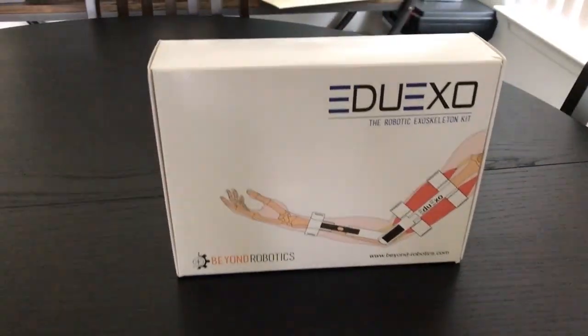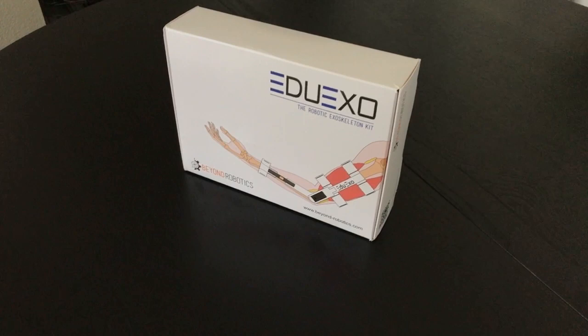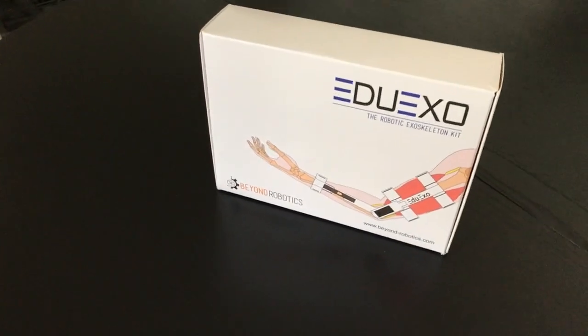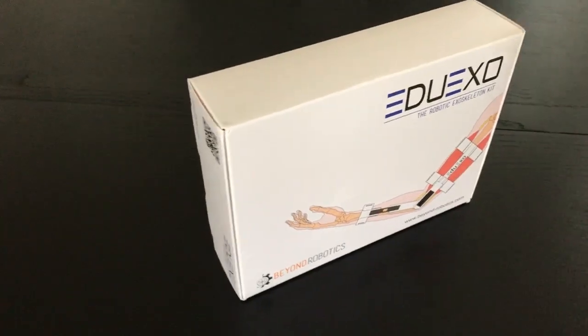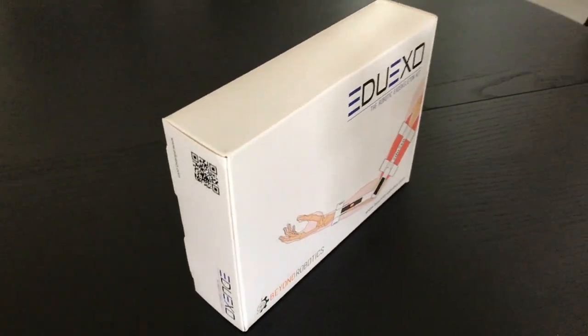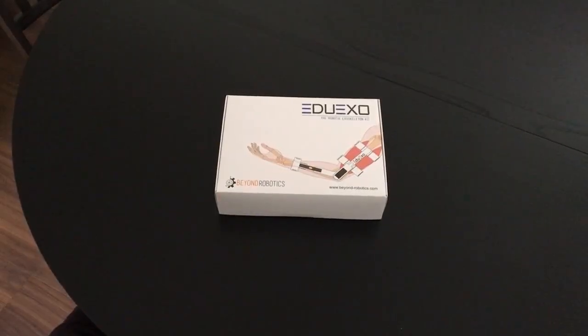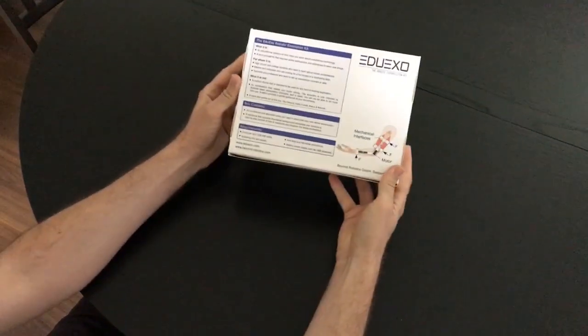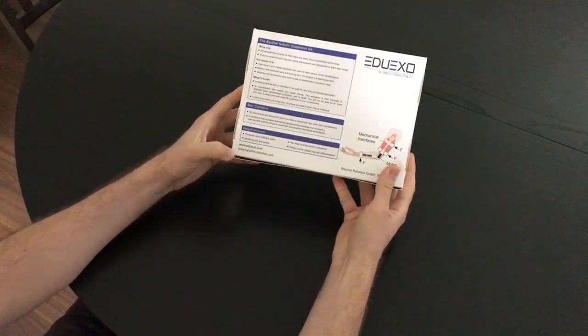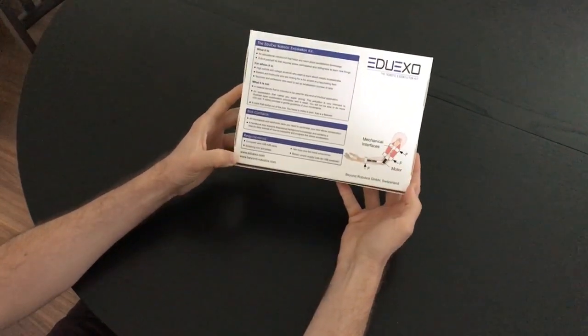Hey guys, it's Bobby from the Exoskeleton Report. Today we have a special treat for you — we have an EduExo kit and we'll be opening it right now. The EduExo comes in a nice little box like this, and in the back you can see everything that's included, plus the website for both the manufacturer and the kit itself.